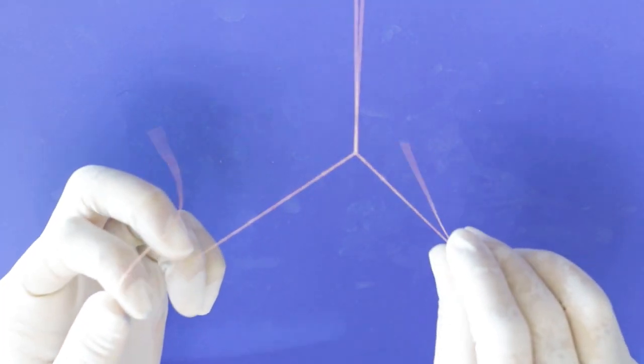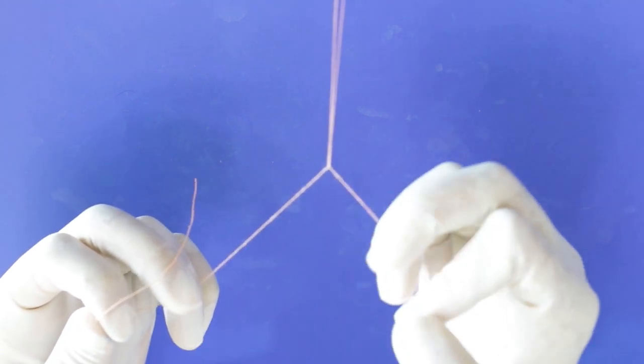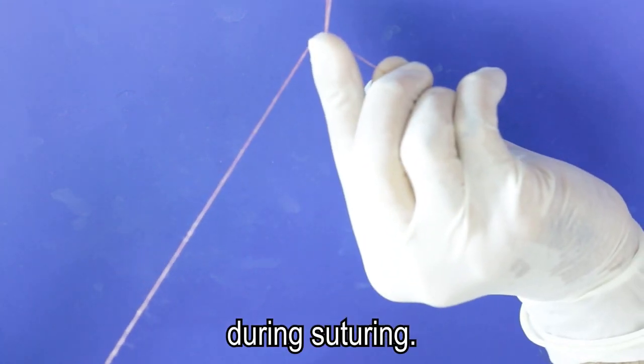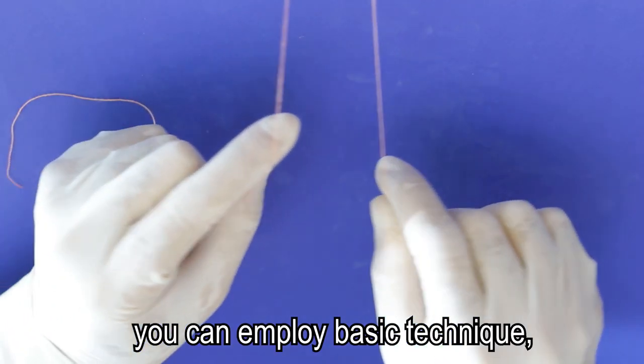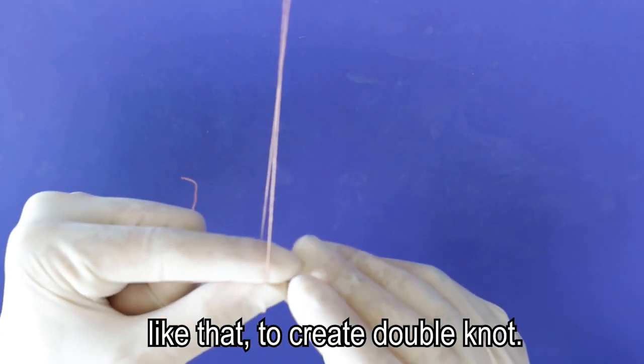By this way, a double knot is achieved and you can eliminate the losing risk of the knot during suturing. If it seems hard for you, you can employ the basic technique like that to create a double knot.